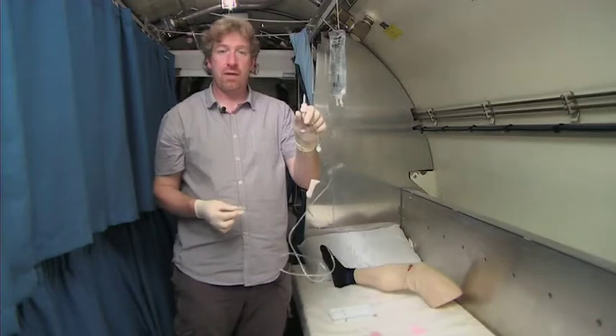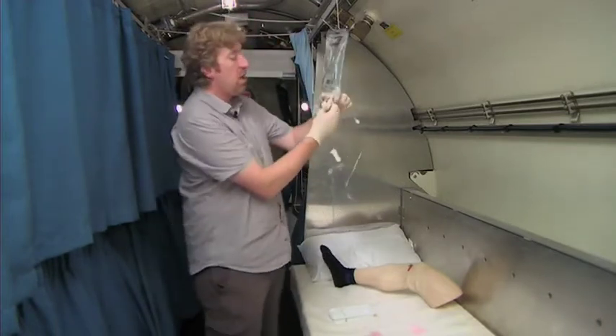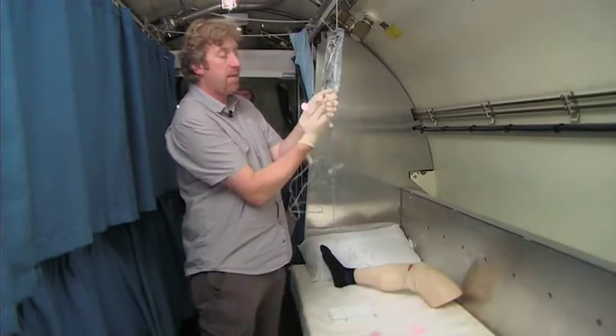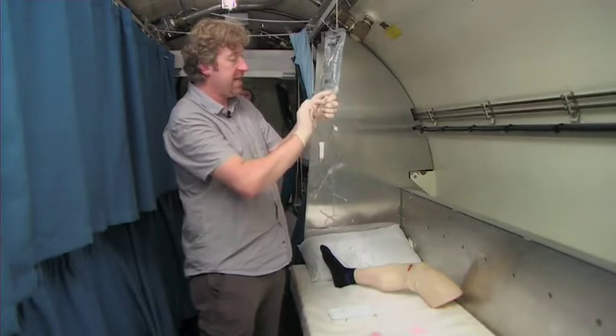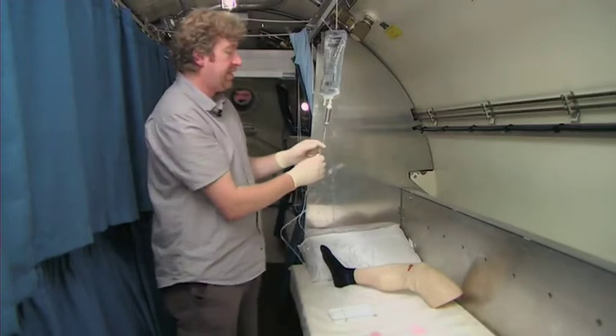Next, remove the cap off the protective spike, twist the cap off the infusion bag port, insert the spike in, twisting until it's in place.